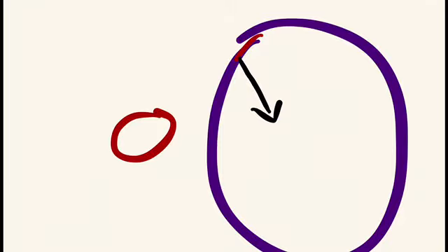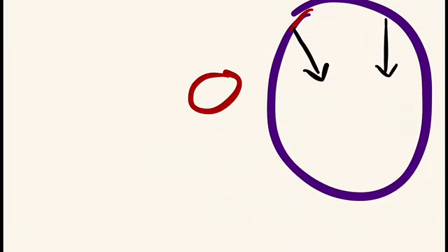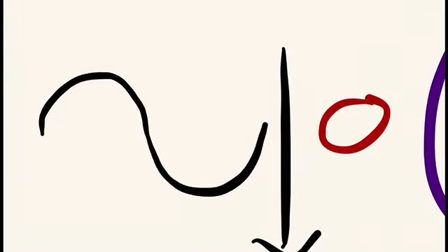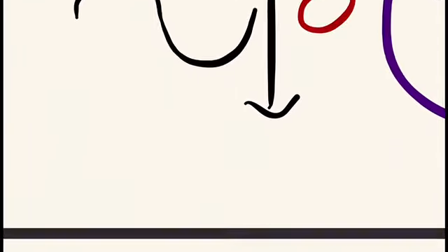The left atrial depolarization vector is in this direction for V1, okay. Now the resultant vector will be in this direction, okay. So first the wave will go towards V1, then go away from V1, okay. So this was the basic idea behind why V1 is showing a curved or S type of wave, okay.